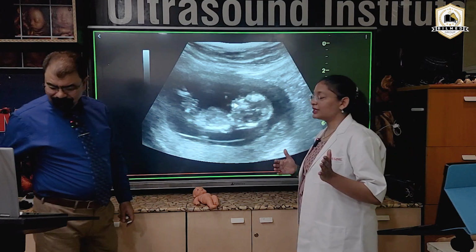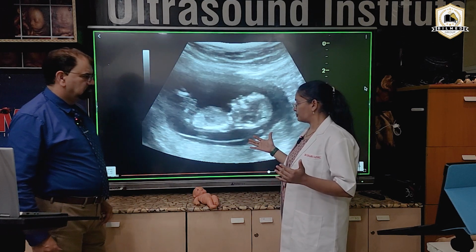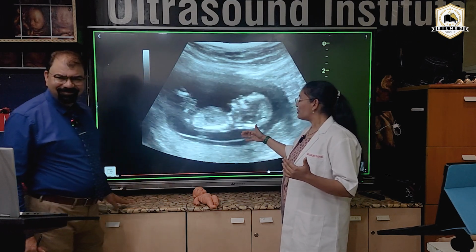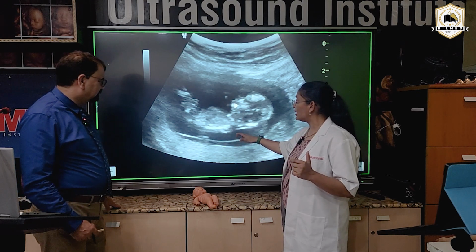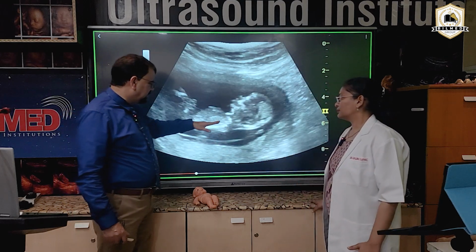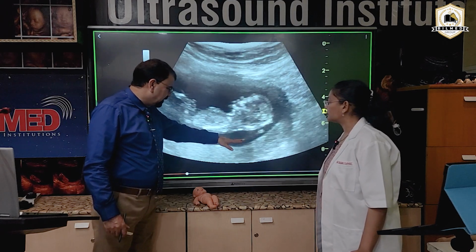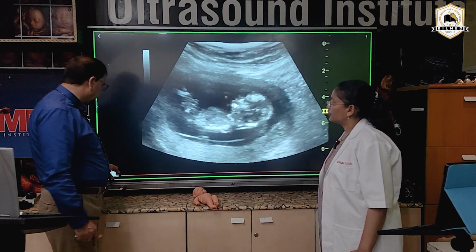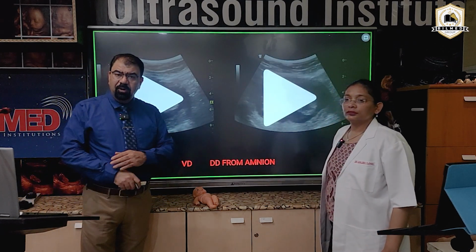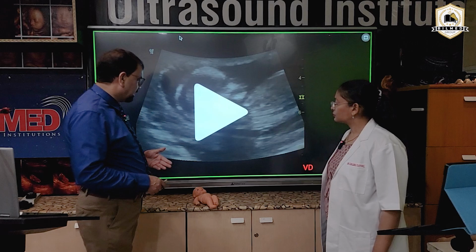Basically, when the baby moves and the view changes, you can easily differentiate that this is an amnion and this is separate from the nuchal translucency. When the fetus moves, it will take the NT along because NT is part of the fetus, but the amnion is not part of the fetus. This way, sometimes you may get fooled. So wait for fetal movements to see whether you are dealing with a true NT or an amnion.